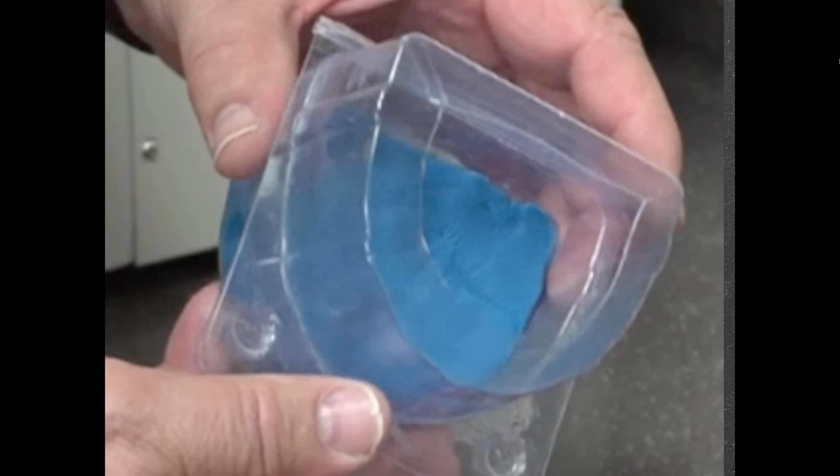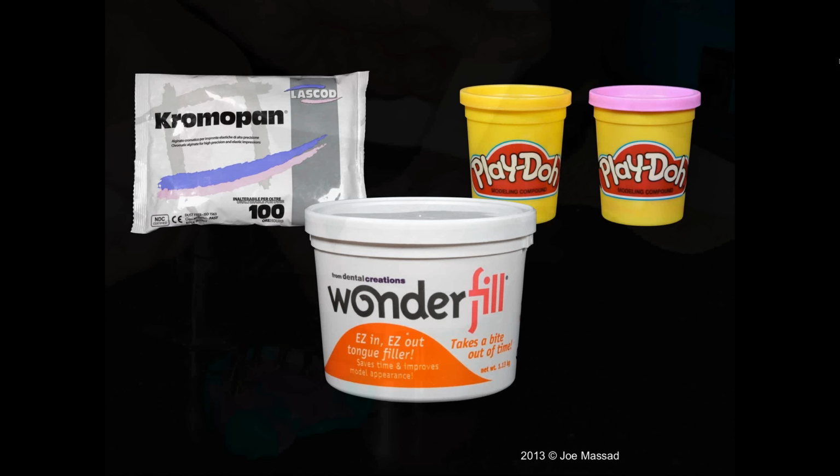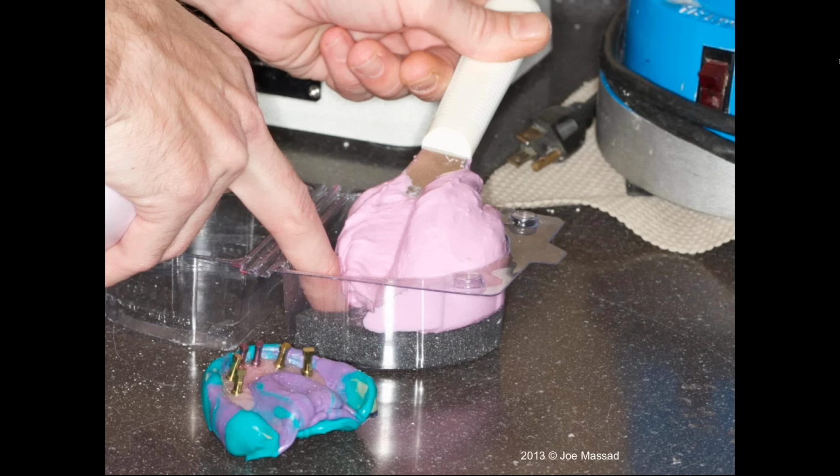And I'm going to box the impression with either an alginate, maybe that little Play-Doh, or a little bit of Wonderfill, just so I will have it boxed nicely, and I want to do this rather quickly and accurately. So in this case, we're actually putting the alginate. This particular alginate has a 100-hour life, and so you can make several models on this, but it won't desiccate for several days.